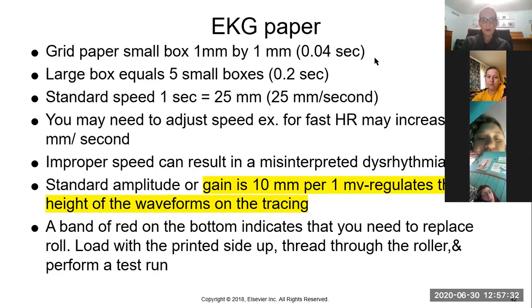But the normal is right here. You always keep it on this unless it has been prescribed to go faster or slower for some other reason. Okay.